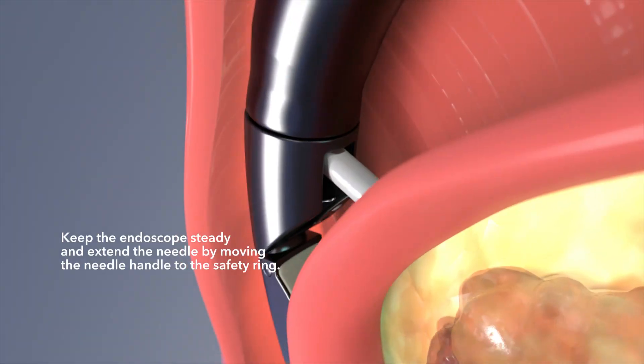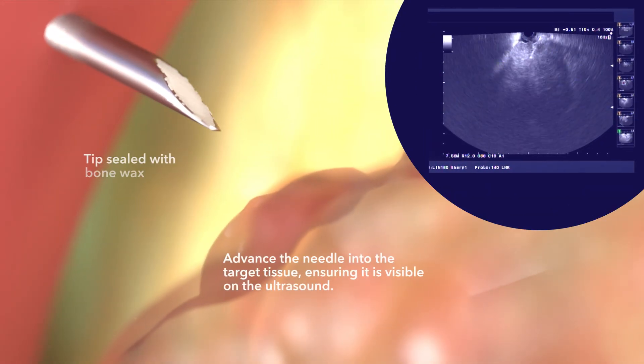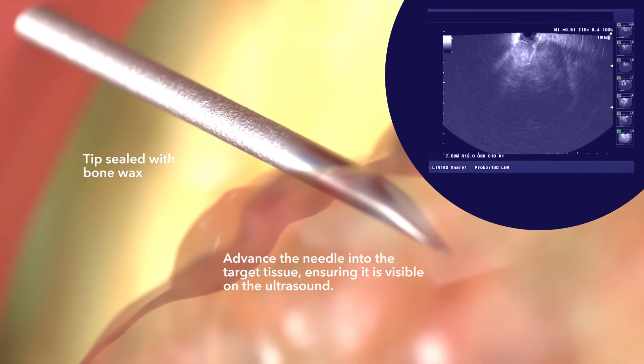Keep the endoscope steady and extend the needle by moving the needle handle to the safety ring. Advance the needle into the target tissue, ensuring it is visible on the ultrasound.